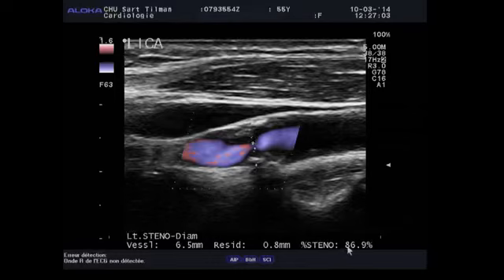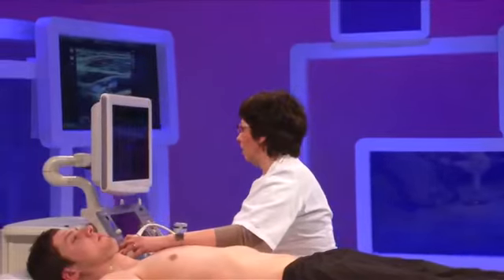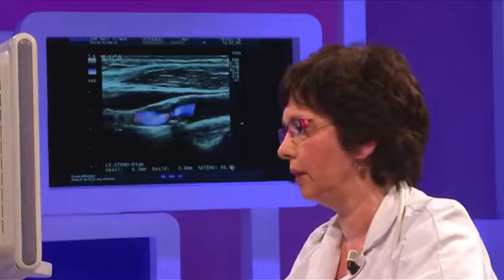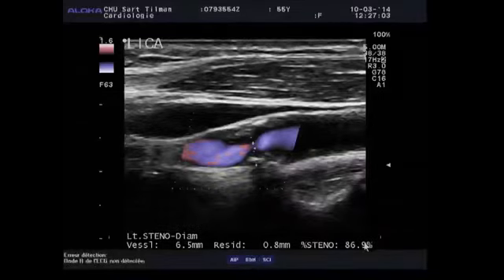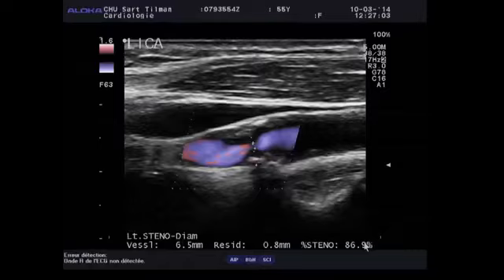So usually we must use the NASCET vocabulary because it corresponds to CT scan and MRI, and usually we don't use ECST. If you want to use ECST measurement, you must specify it and be cautious, because people who will read your paper maybe won't understand what you've said. So I think it's much safer to use NASCET.